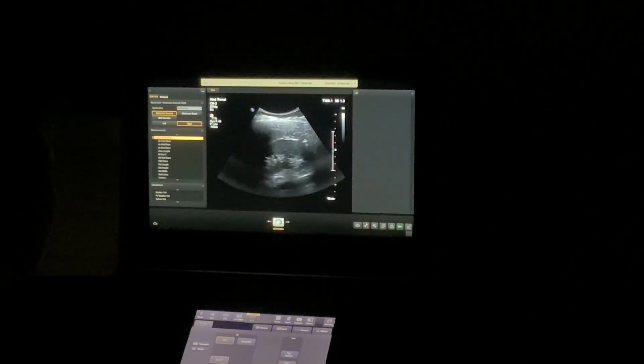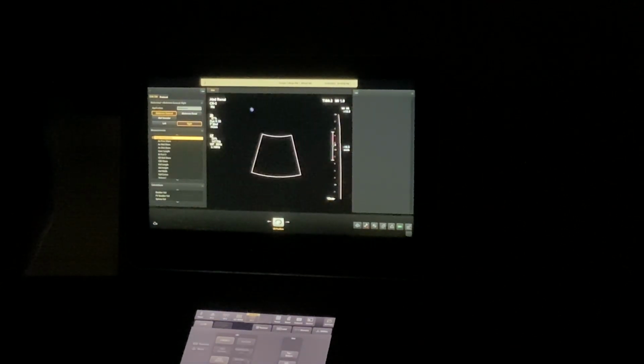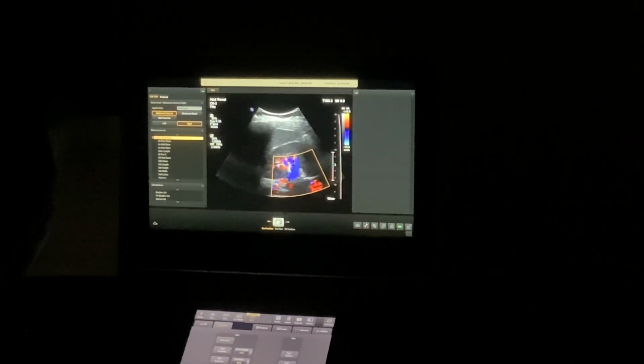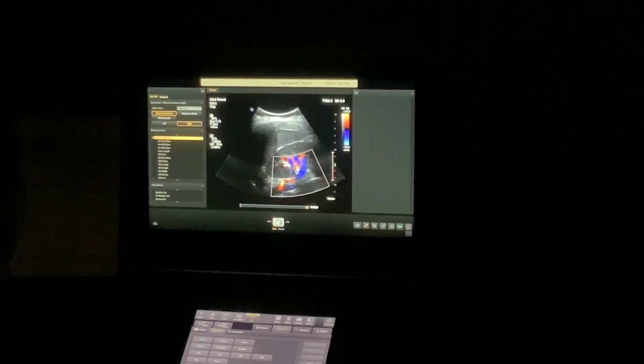Beautiful. Especially when you learn how to do renal Dopplers. That's going to be very important, and I'll show you why. Look at that. Small breath. Wow. Hernandez has really good renal Doppler vessels. Practice on her when y'all get to that in your senior year. Breathe. Yeah. This is her renal artery coming off the aorta and going into her kidney.